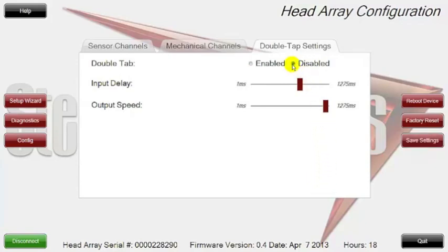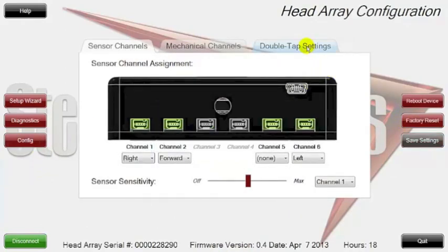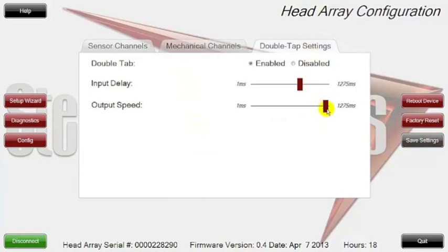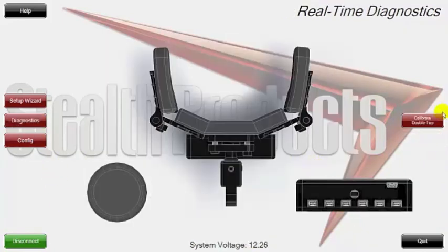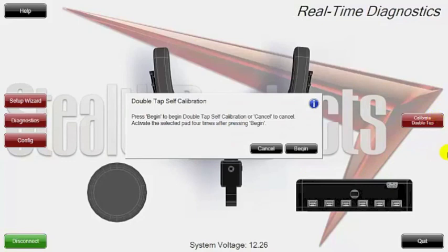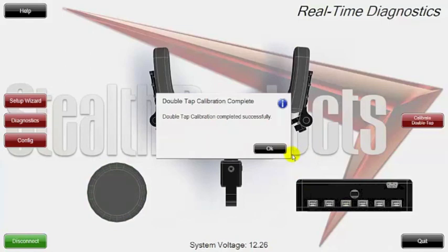Normally the unit is set to disabled, but since it's already been pre-programmed, we have it on enable right now. We're going into the diagnostics mode and you'll see that calibrate double tap is now on red, letting you know it's ready to be calibrated. I want to show you the settings first — we're going to bring all these to the middle, right around 50%, and save these settings. Then we're going to come into the diagnostics mode and do a double click for calibration. You can see the double tap was calibrated successfully.